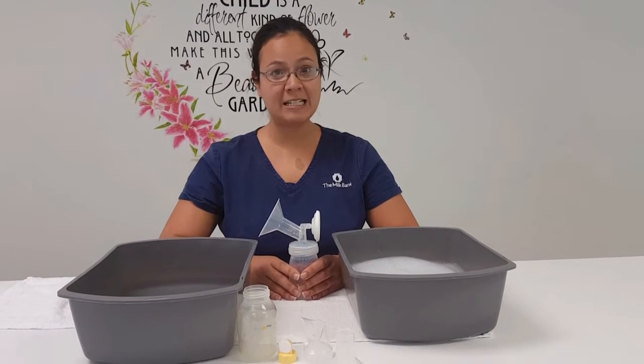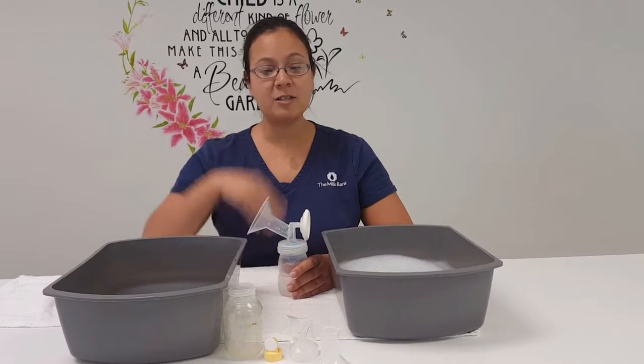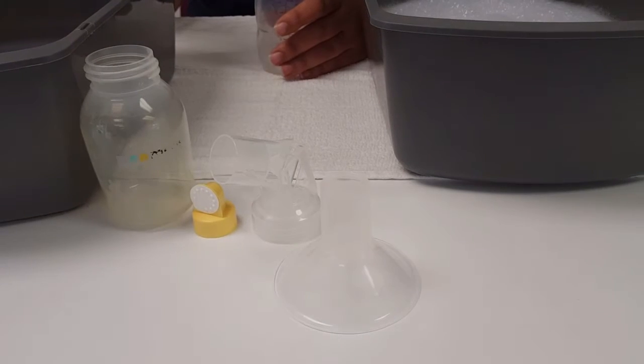So today we're just going to take a couple quick minutes to show you how to properly take apart your pump parts and how to wash them. So I have here just kind of a couple different displays of different pump parts. Some of them come apart into more pieces than others.